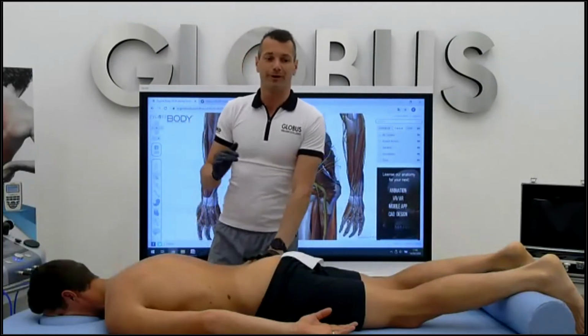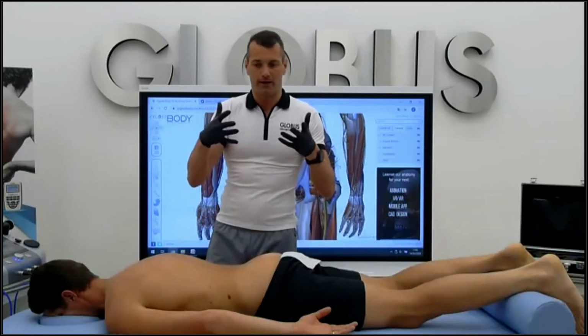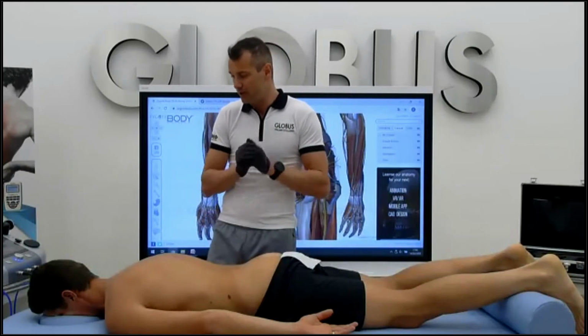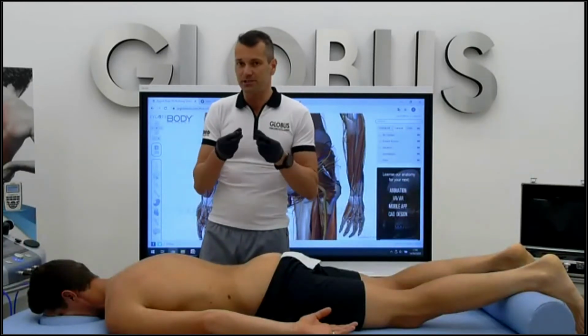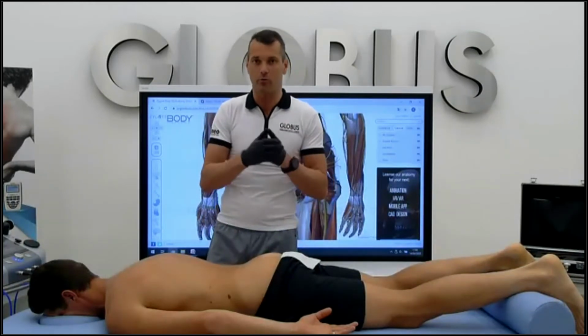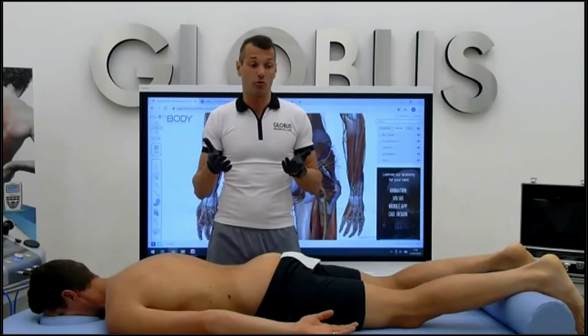So the vascularization part, the capacitive part, is absolutely important for having a homogeneous vascularization of the tissue. Then, when the tissue starts to sweat, when we reach the specific window and we stay on the window for several minutes, we can start with the tools, but with not so much energy.